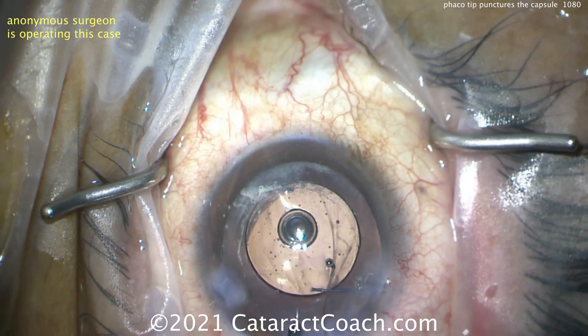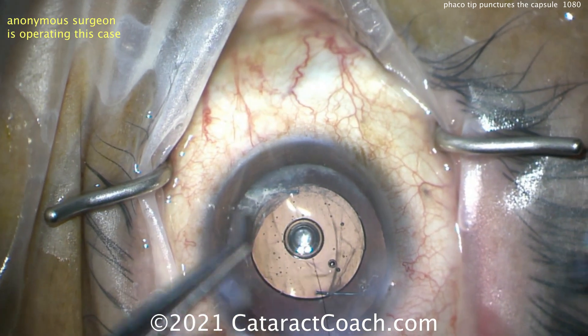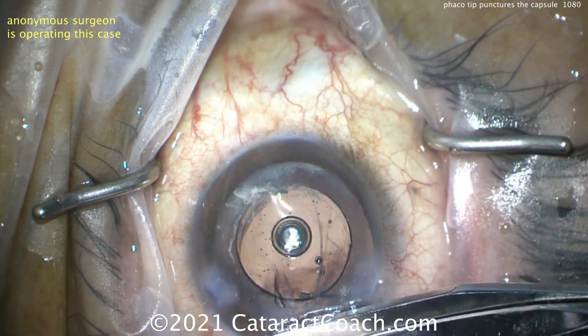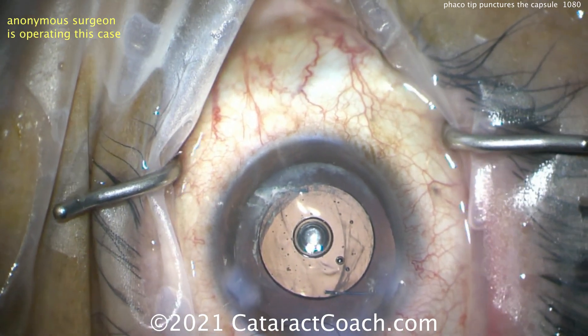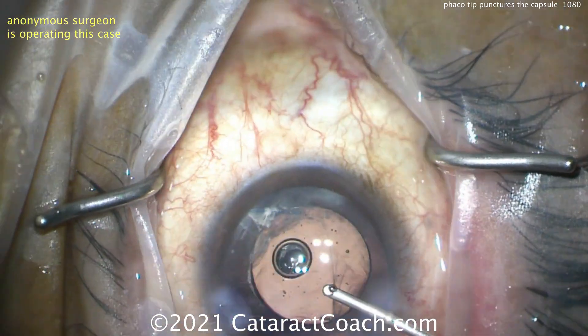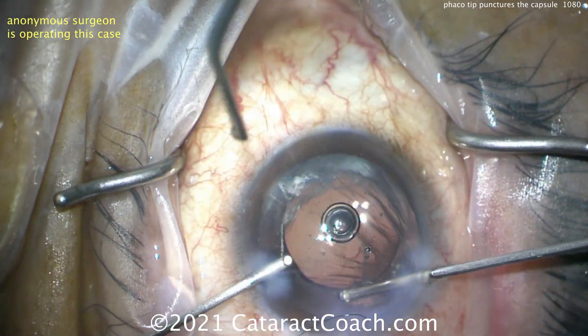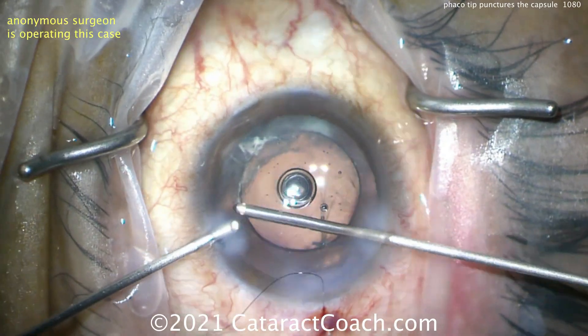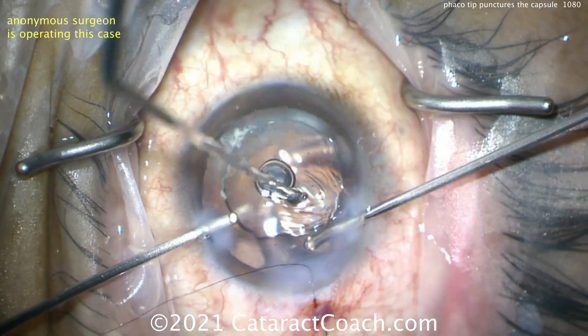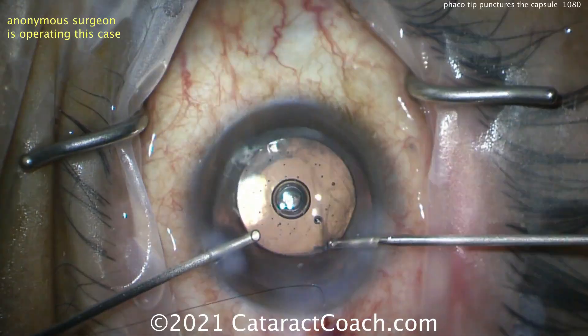So this is not going to be sufficient. Let's put in a suture and close up that main incision — that's actually a smart move. You're not going to use the main incision anymore; you're just going to use the two side-port paracentesis incisions to do the bimanual anterior vitrectomy. I think you can still do it with this lens in position. Going back in — you really have to clean up that prolapsed vitreous.